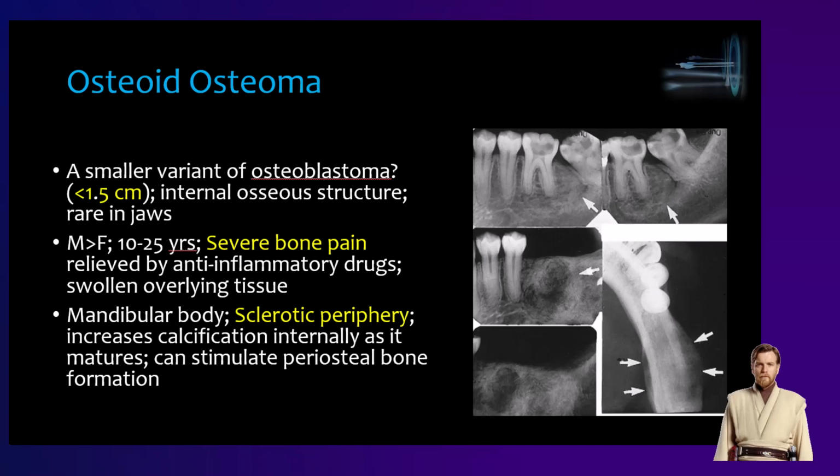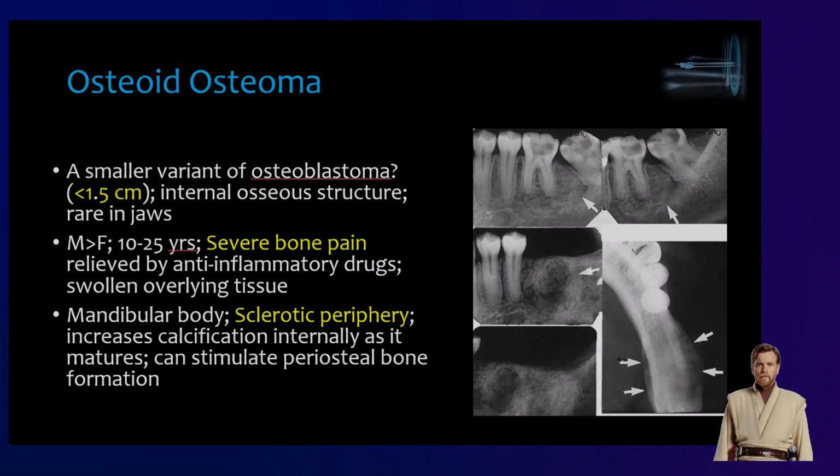All right, welcome back. This is part 2 of your COO lectures, your well-defined radiopacities with radiolucent rims. In this one, we're going to go on to osteoid osteomas and then osteoblastoma, which is like a larger variant of the osteoid osteoma. Then we'll talk about osteomyelitis sequestra, and we'll finish off with some cases to test how much you've learned. Let's get going.